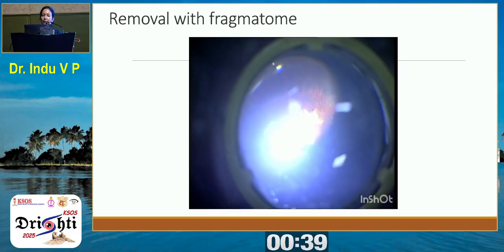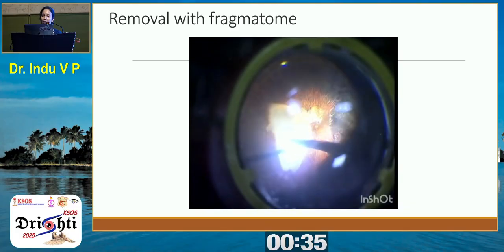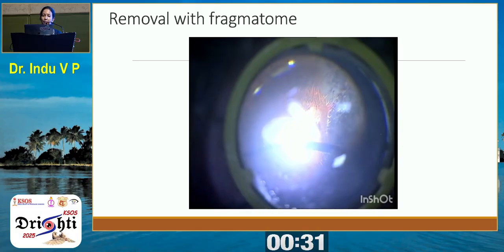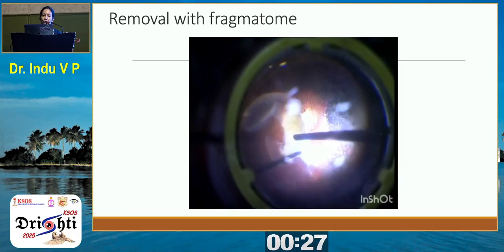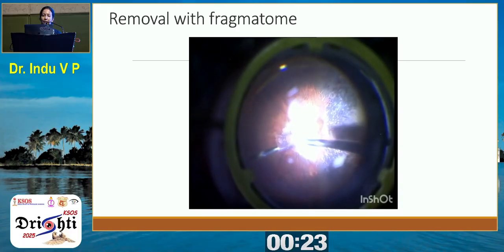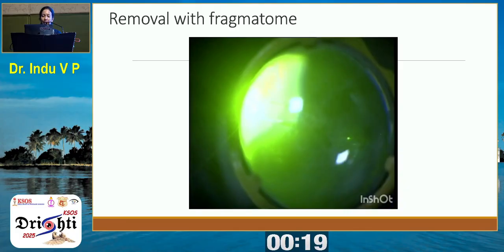So you can see this is a high myope. You can see a lot of myopic macular degeneration. So this patient was taken up as a second procedure after taking a proper consent for vitrectomy and tamponade, because intraoperatively there is a very high chance for breaks and retinal detachment. Fortunately, the patient did not have a retinal detachment or a break, and I could leave the patient without any tamponade.